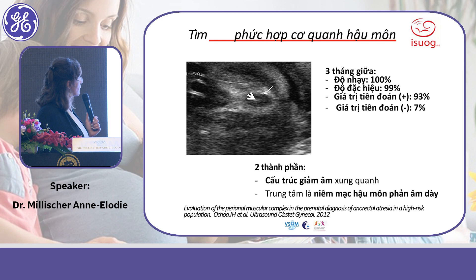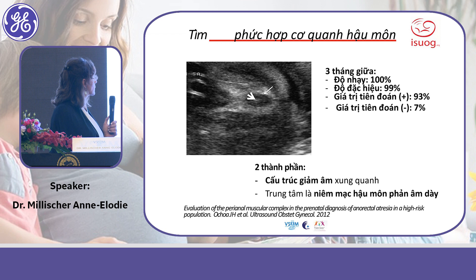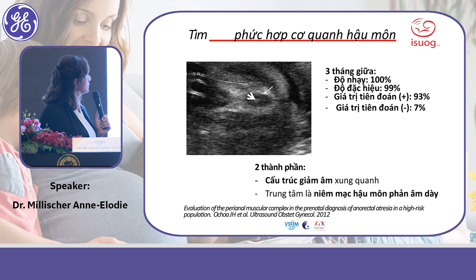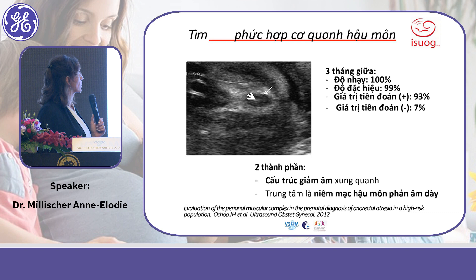On routine ultrasound we must always examine the anal region. At the anal position, we look at two components: the hypoechoic area surrounding — the hypoechoic ring which is the muscular sphincter of the anus — and the hyperechoic central area which is the anal mucosa.